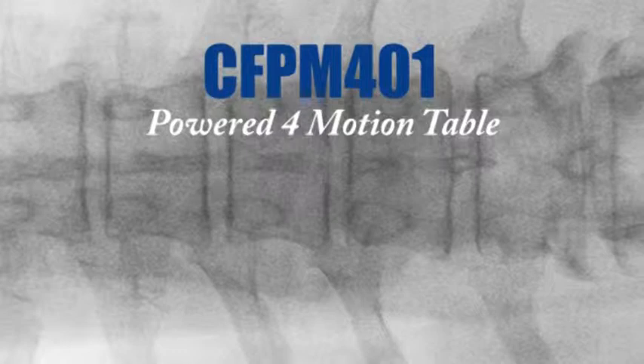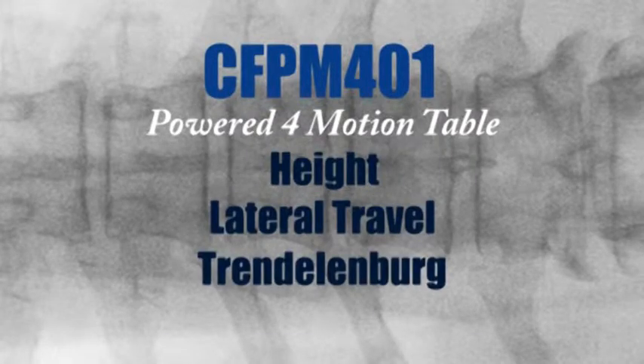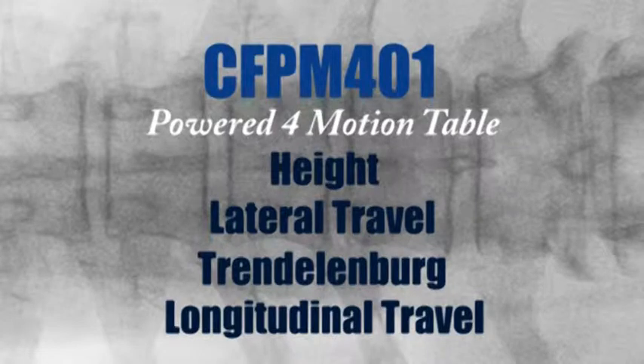OakWorks CFPM 401 has four powered motions: height, lateral travel, Trendelenburg, and longitudinal travel, giving you the flexibility you need for optimal imaging.